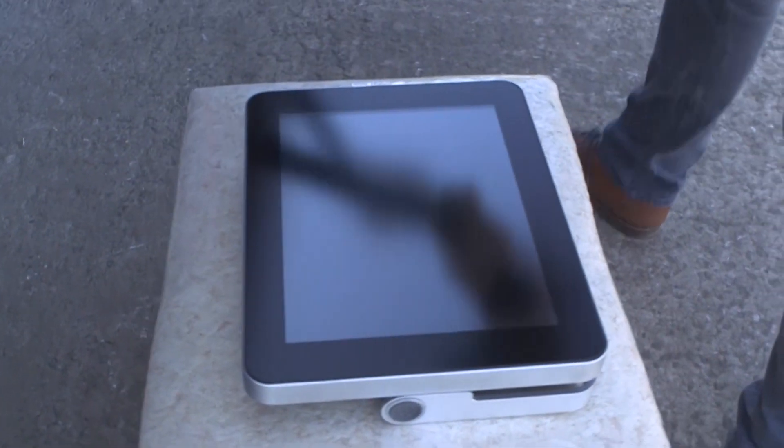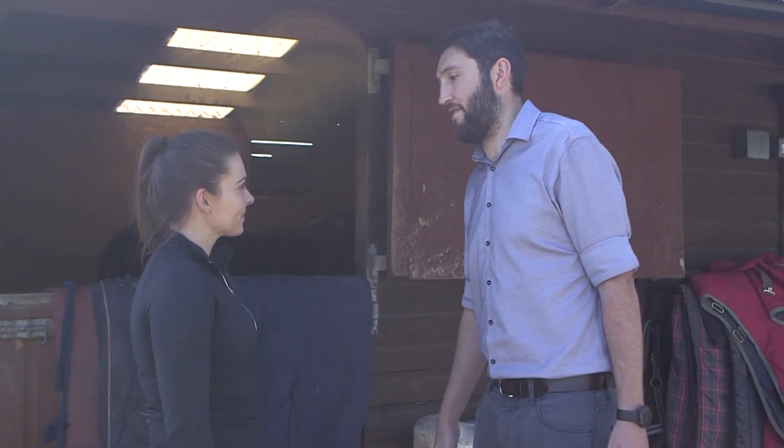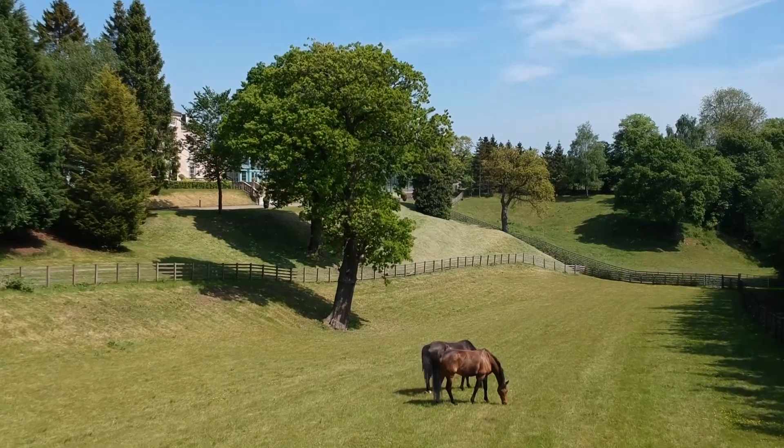The Exapad from IMV Imaging allows you to develop a strong partnership with your clients, excelling in equine scanning.